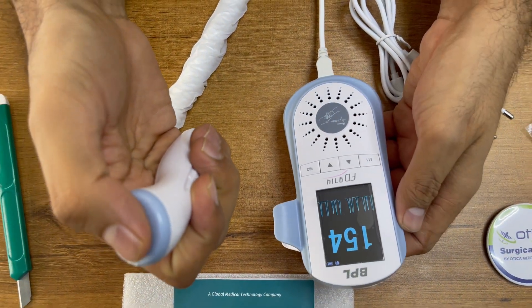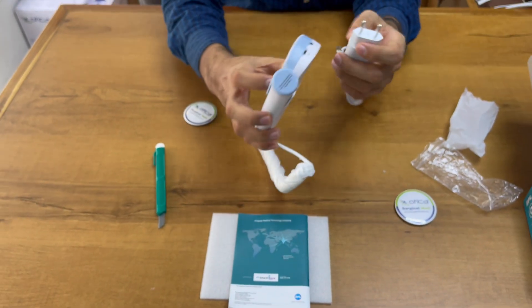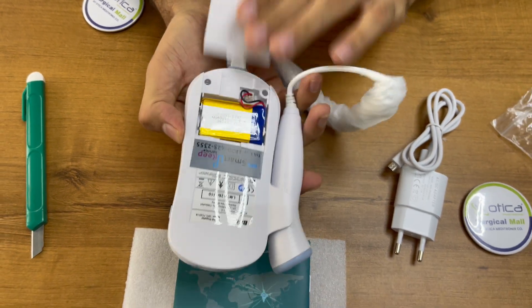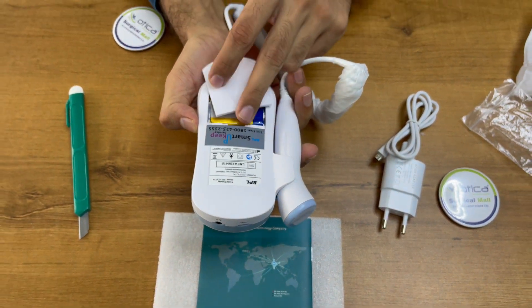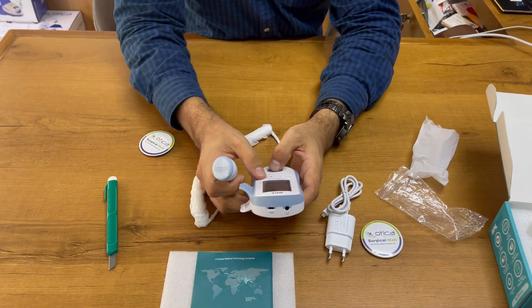This is how simple it is. This is the BPL Fetal Doppler. You can charge it here. On the top of the machine they have provided the charging indicator. It is rechargeable — they have given a 1180 milliampere-hour battery. It is a good device and comes with a one year standard warranty. That's it, thank you.